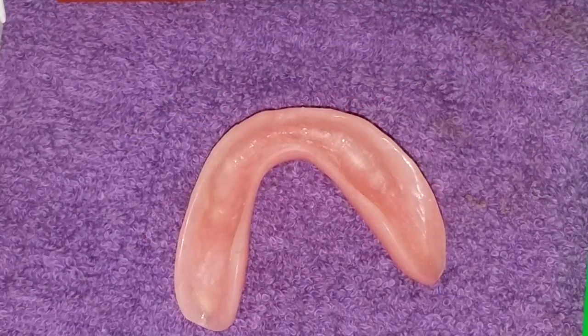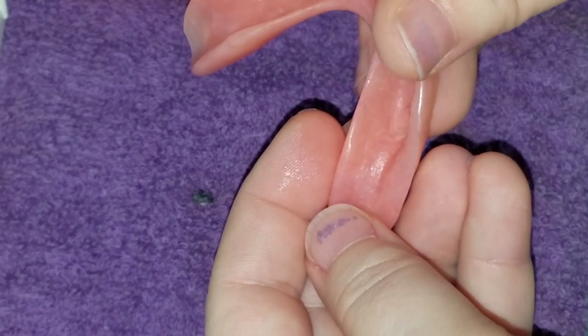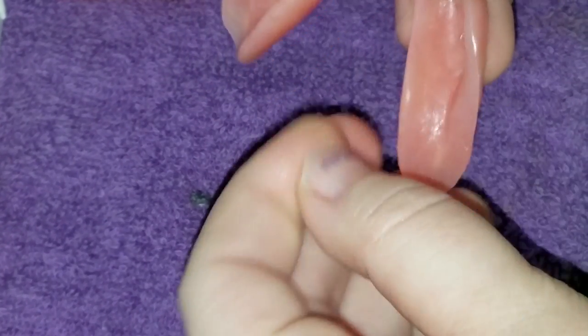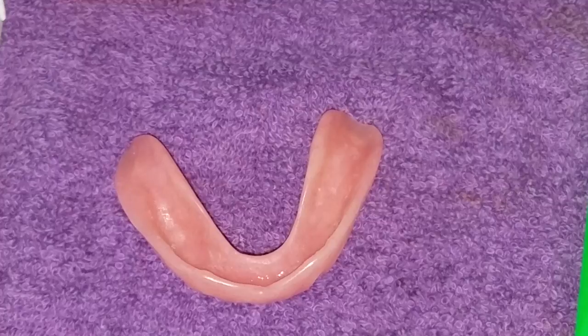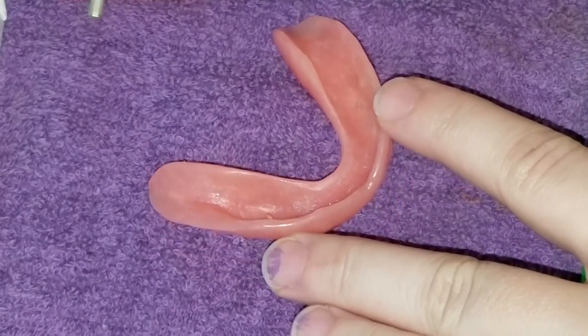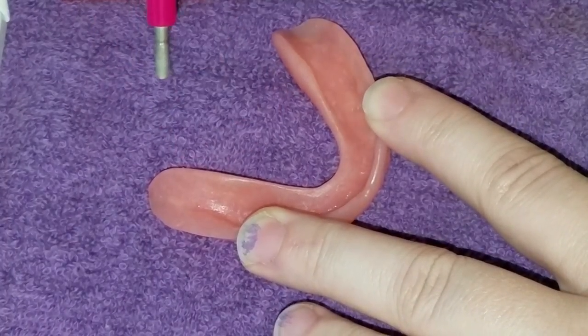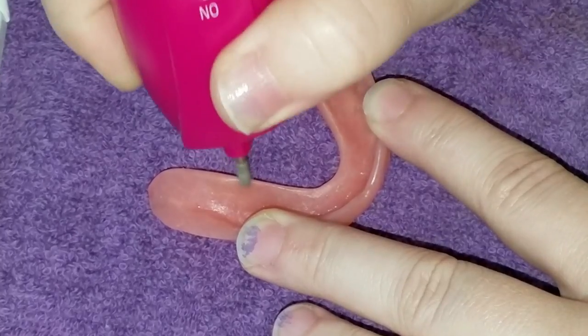I want to double-check the site where I want to make my adjustment — yep, right here. In the light I can see there's a little lip right here. I'll dry the spit off my hands, spin this up, and just take a very little bit off. We don't want to cause problems.